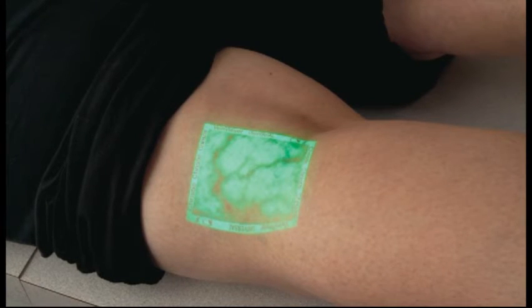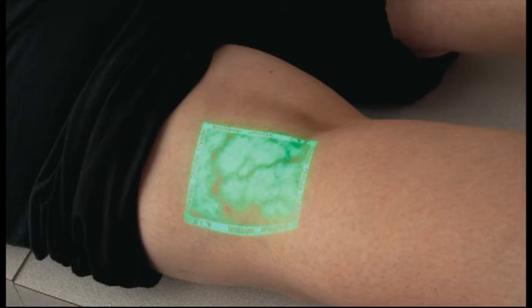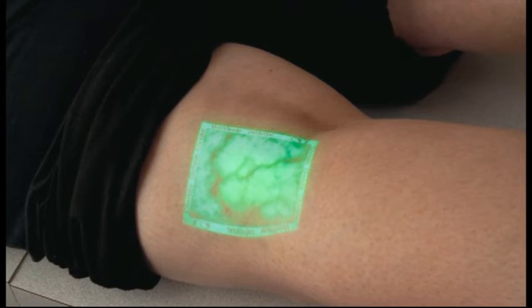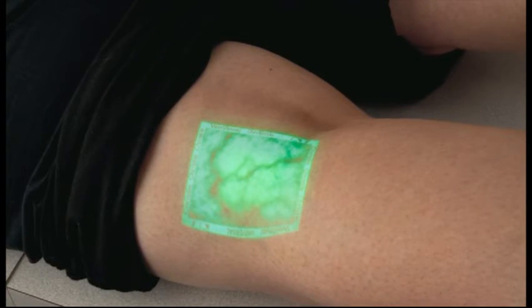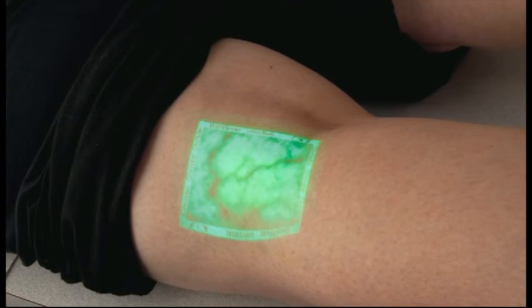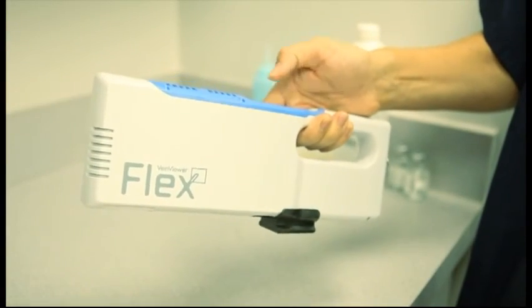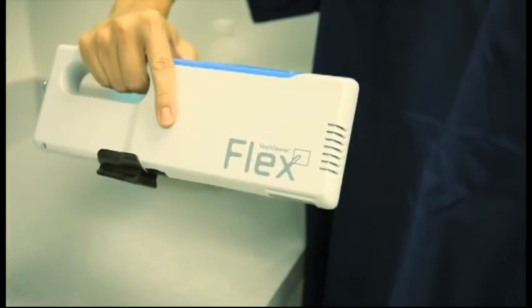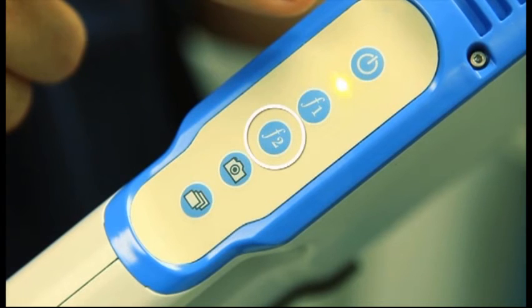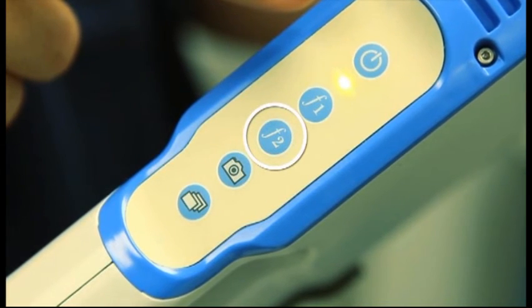Optional mode Max Bright increases the lumen output of the VainViewer image from approximately 6 lumens to 10 to improve visibility in circumstances with brighter than standard indoor lighting conditions. Once this mode has been purchased and unlocked, activate Max Bright by pressing the function button assigned to the feature during product setup. Max Bright is only available for EMS or ambulance customers.